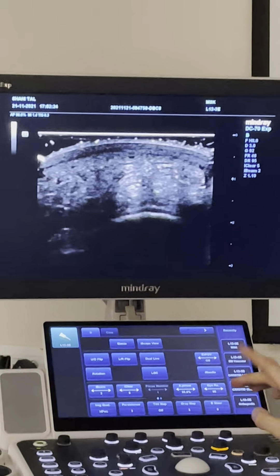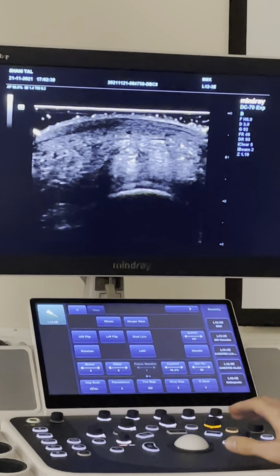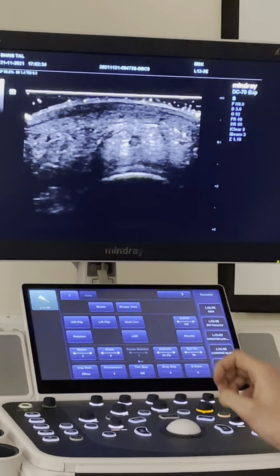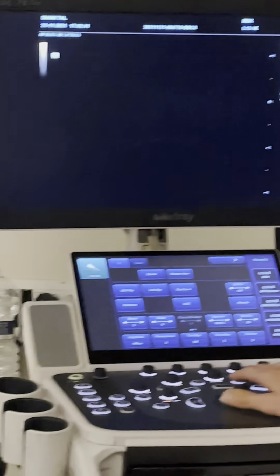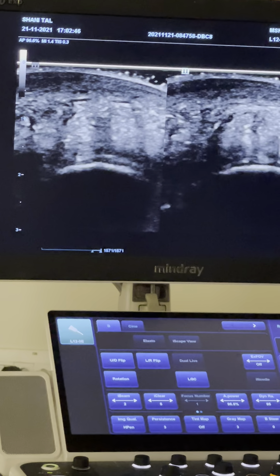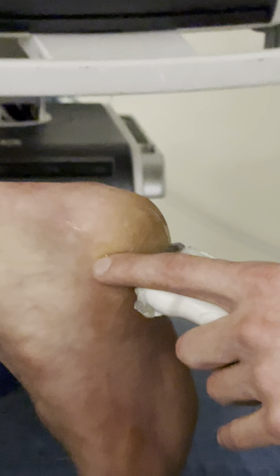So if I use this and make a dual screen — I have found it. This one is totally without pressure. And now I stay at the same image. You see my finger is making contact with the skin so I don't lose the position I have over here. So this is the same image.